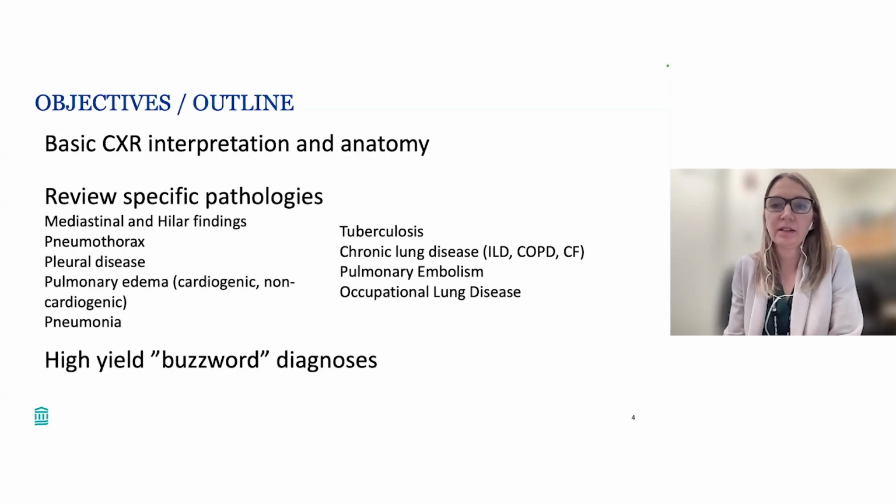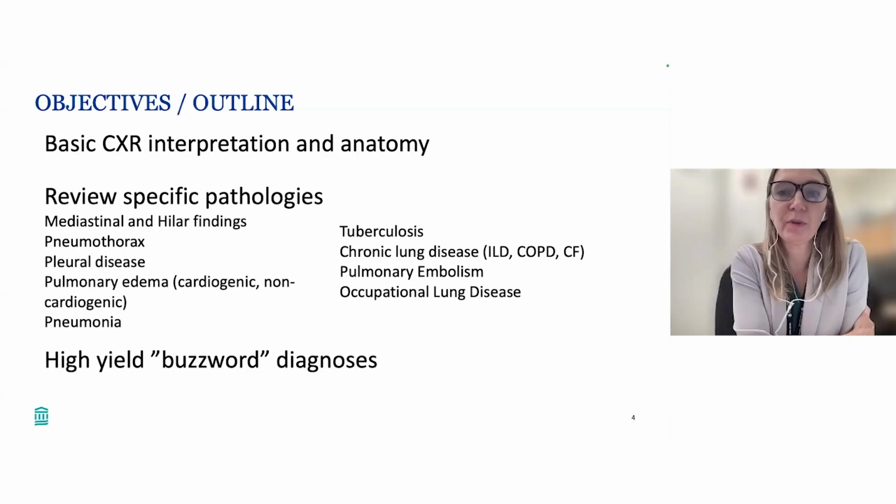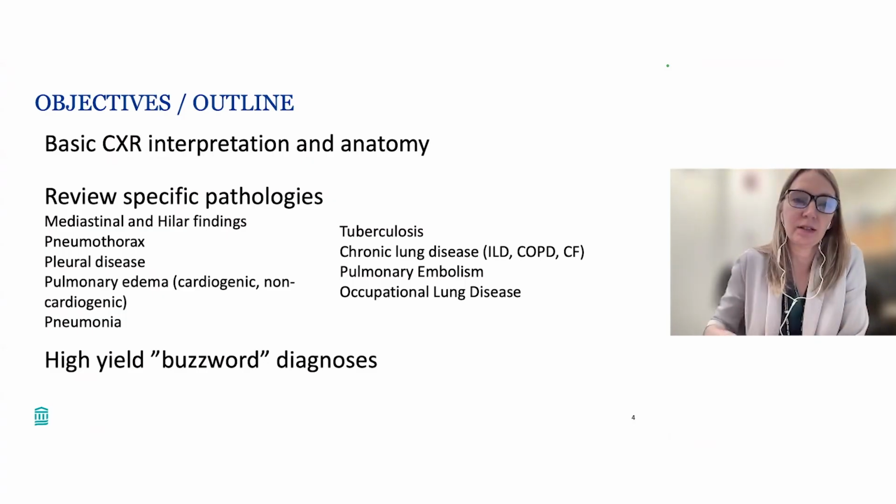Here's a basic outline of what we will talk about today. We will start by going over basic chest x-ray interpretation and anatomy. Then we will review specific pathologies that are relevant to the boards that are shown here. And at the end, we will review high-yield buzzword diagnoses for the boards and give you some example questions.